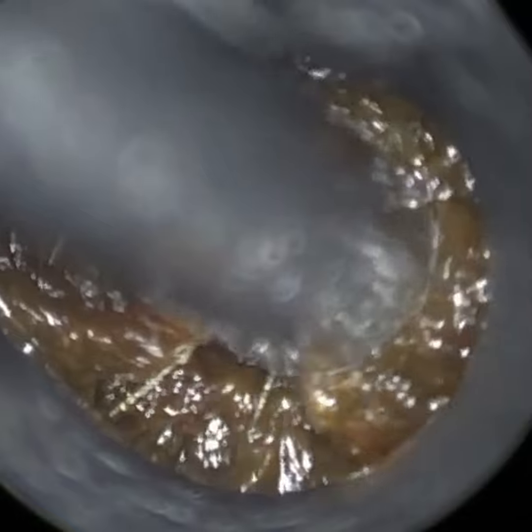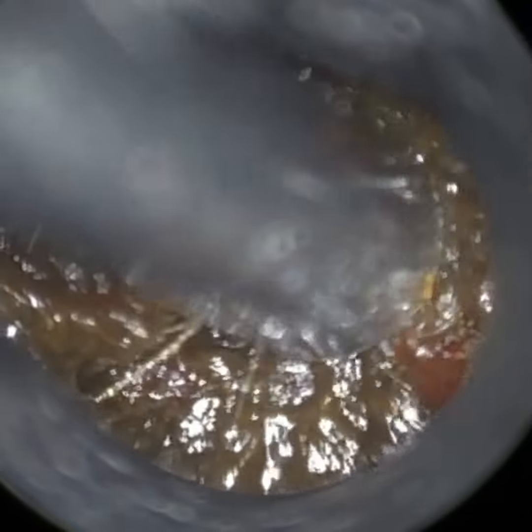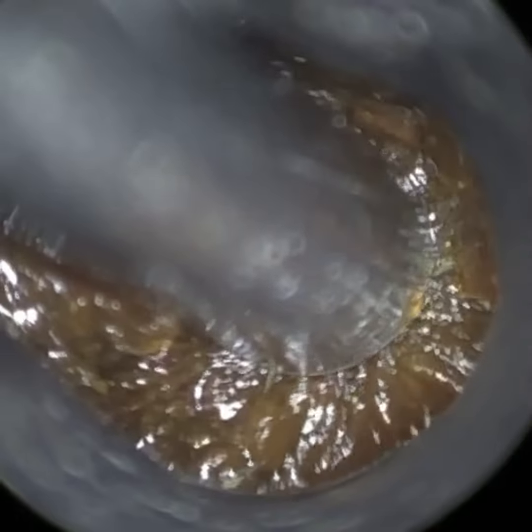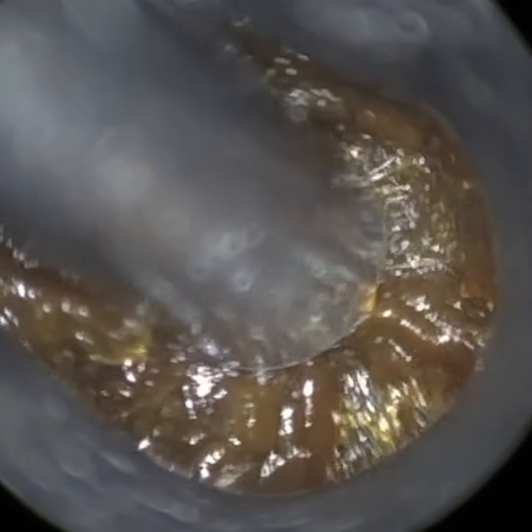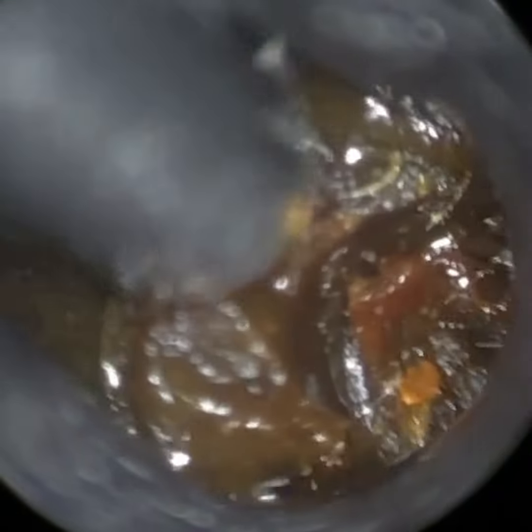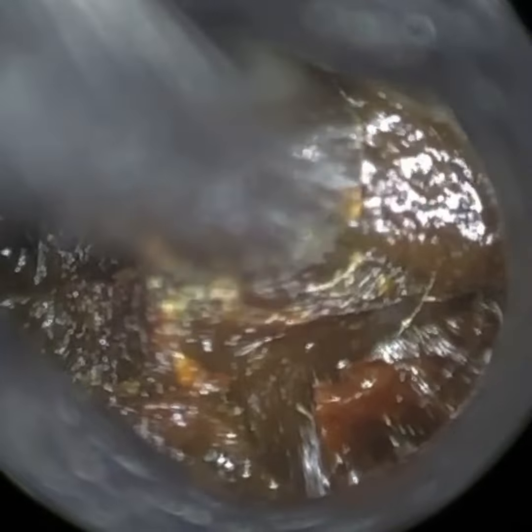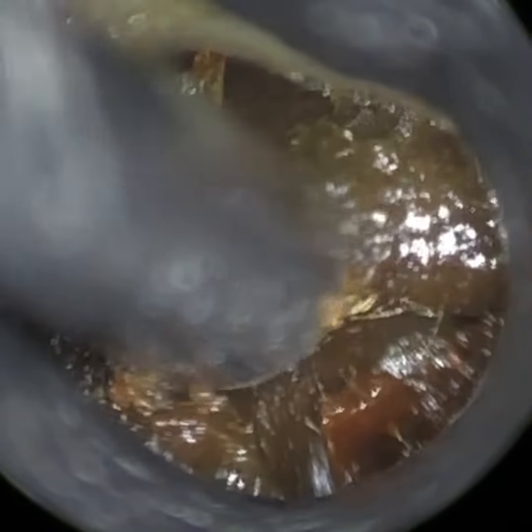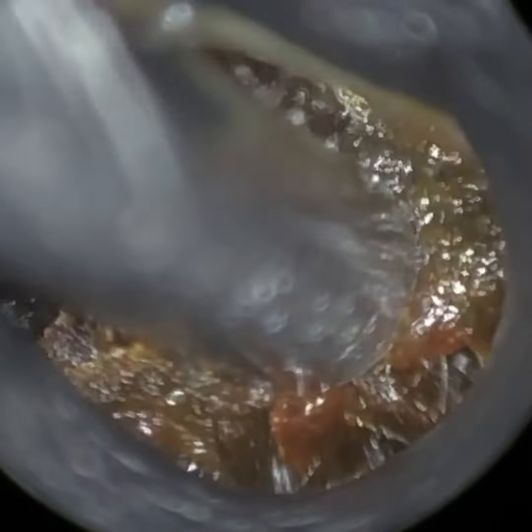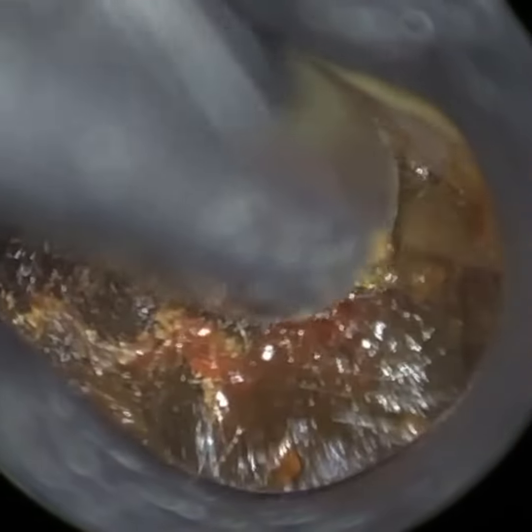When I first started using spray during the procedure I used to let it soak, then drain and go back in. With an endoscope sometimes that is the best method because the lens of the endoscope can get blurred. But with the Waxscope it's like a handheld microscope — it's more of an otoscopic, microscopic view, so the lens is not in the ear, therefore there's less blurriness. That's one of the advantages of the Waxscope.